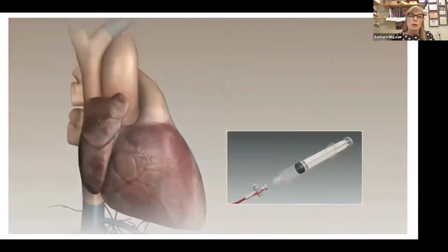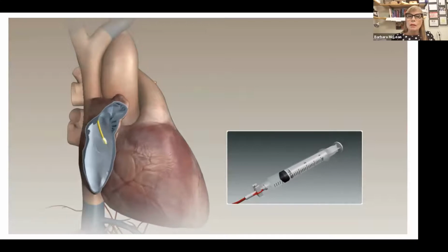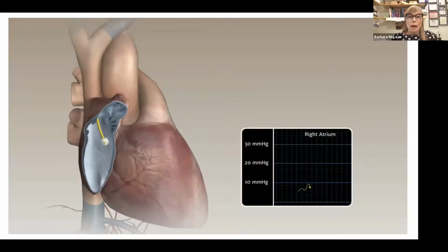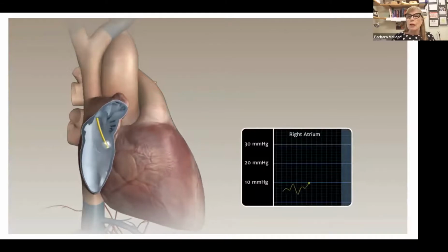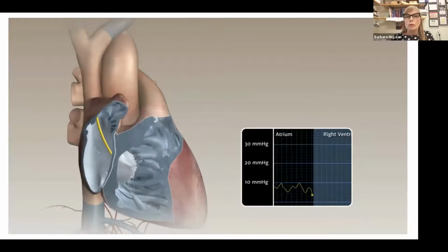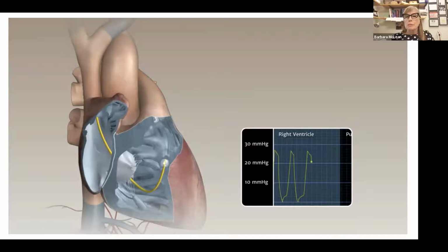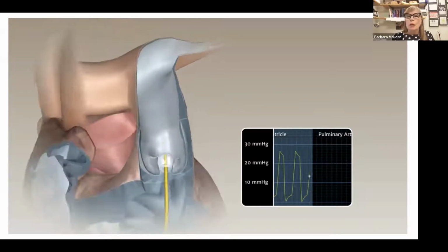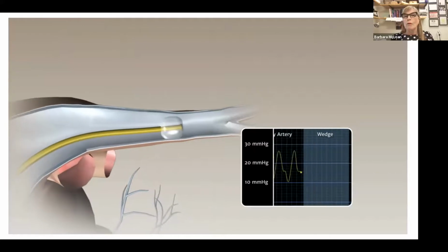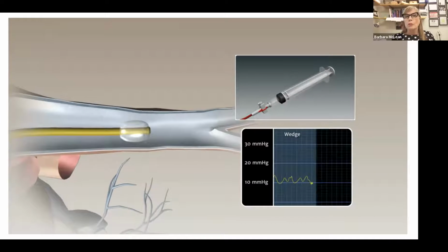going to show us the catheter. So a catheter now has reached the right atria. The balloon will be inflated, and we lock it so that we can sail that catheter. So now you're seeing over on your right-hand side, the visualization of right atrial pressure. The catheter is with gentle pushing through the tricuspid valve into the right ventricle, and with gentle pushing through the pulmonic valve into the pulmonary artery, and out into the arteriole, into the wedge position.